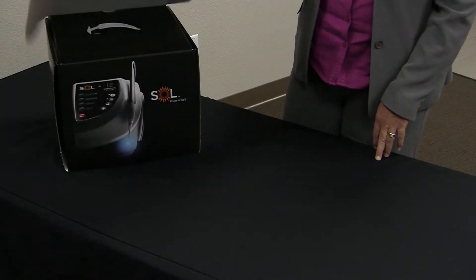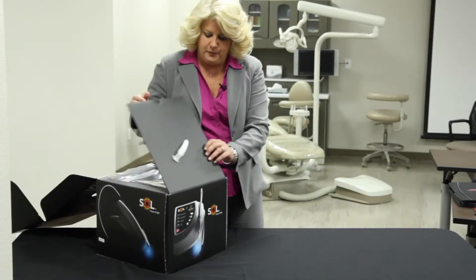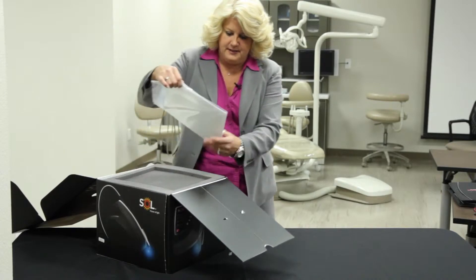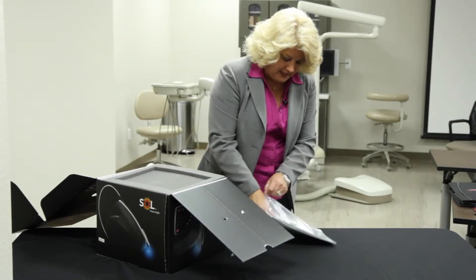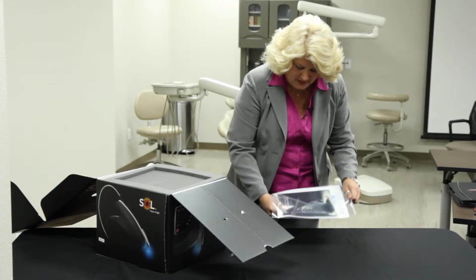So you've now purchased the Sole laser, so we're going to start with the unpack by opening it up. The contents in here — you'll find a clear plastic wrap, and inside it gives you all the explanations of what we're going to cover in today's video.